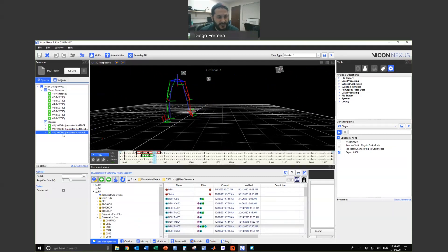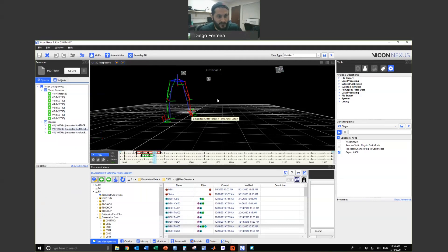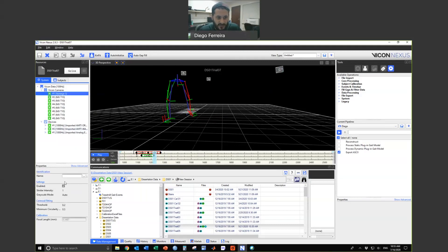For these devices, do not delete any devices, especially on the workspace computer we use to collect data. If you delete a device by right-clicking and removing it, someone who comes after you may no longer have that data without realizing it. You can always add devices, and if you don't want to export them you can skip them — but don't delete them. Also, don't change any camera settings on the other computer, as it may impact data quality. If you don't know, don't touch it — just ask somebody, or call Vicon support.